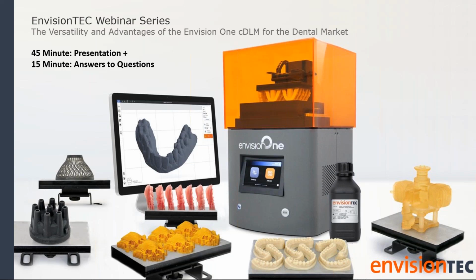So we have another one here. Which one is more accurate, 50 microns or 100 microns, and why? This is an excellent question. When it comes to resolution and accuracy, they go hand in hand. The resolution of a print determines how smooth the surface finish is or how well the details are going to be in the print. The accuracy is determined by your pixel size, but also by the resolution.